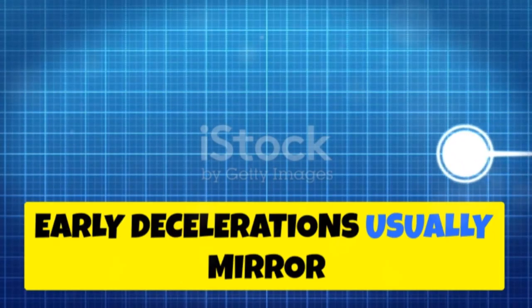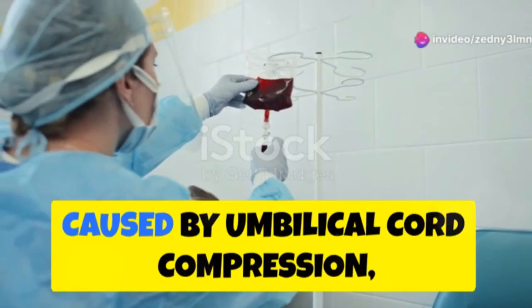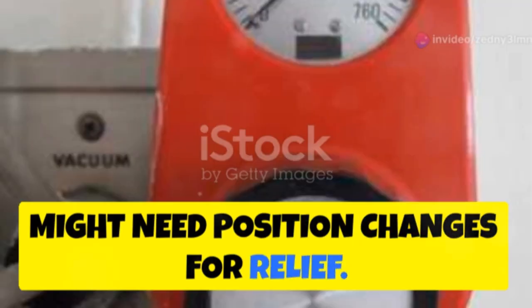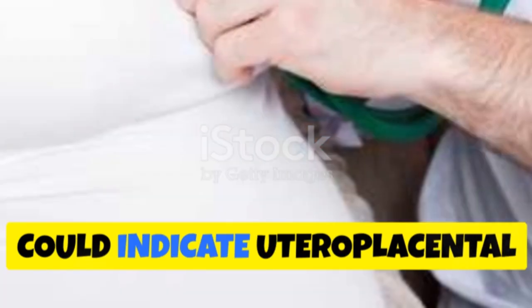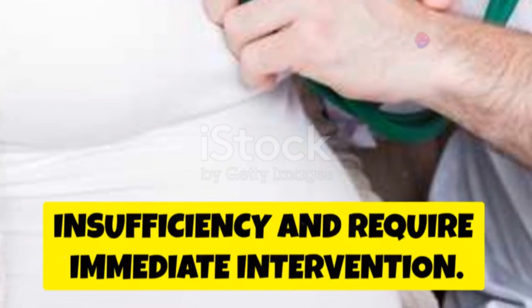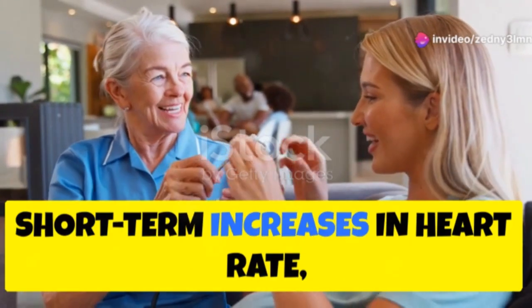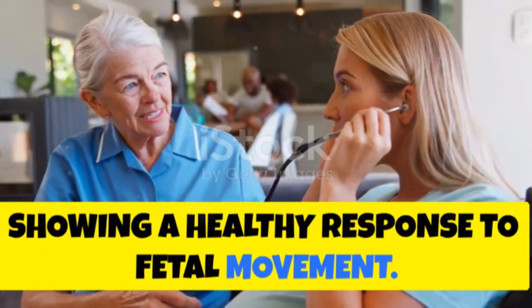Early decelerations usually mirror contractions and are often benign. Variable decelerations caused by umbilical cord compression might need position changes for relief. Late decelerations, starting after the peak of a contraction, could indicate uteroplacental insufficiency and require immediate intervention. Accelerations, short-term increases in heart rate, are typically reassuring, showing a healthy response to fetal movement.